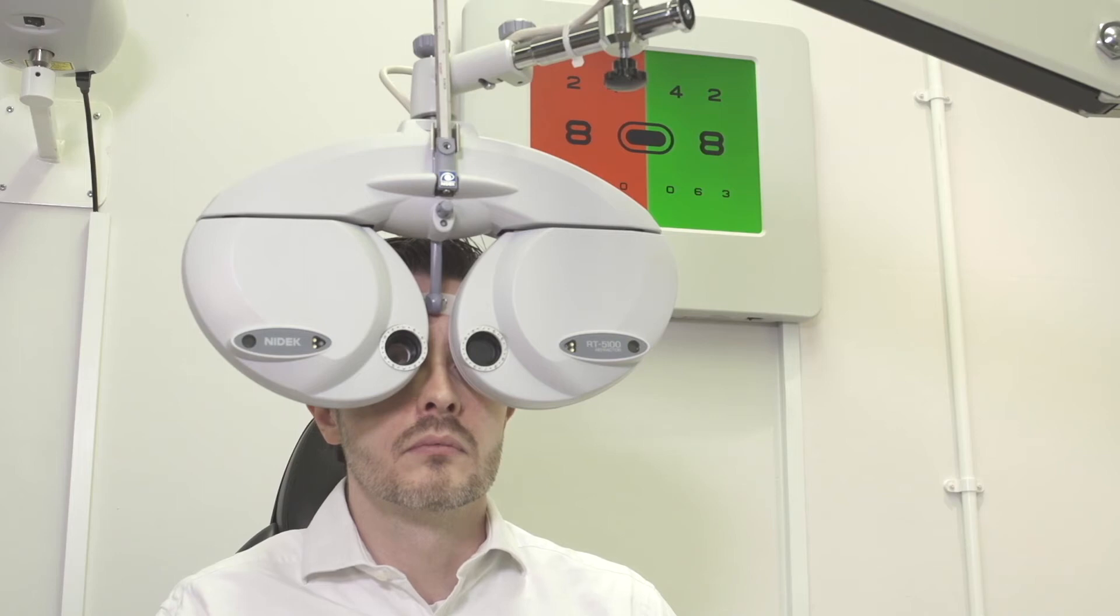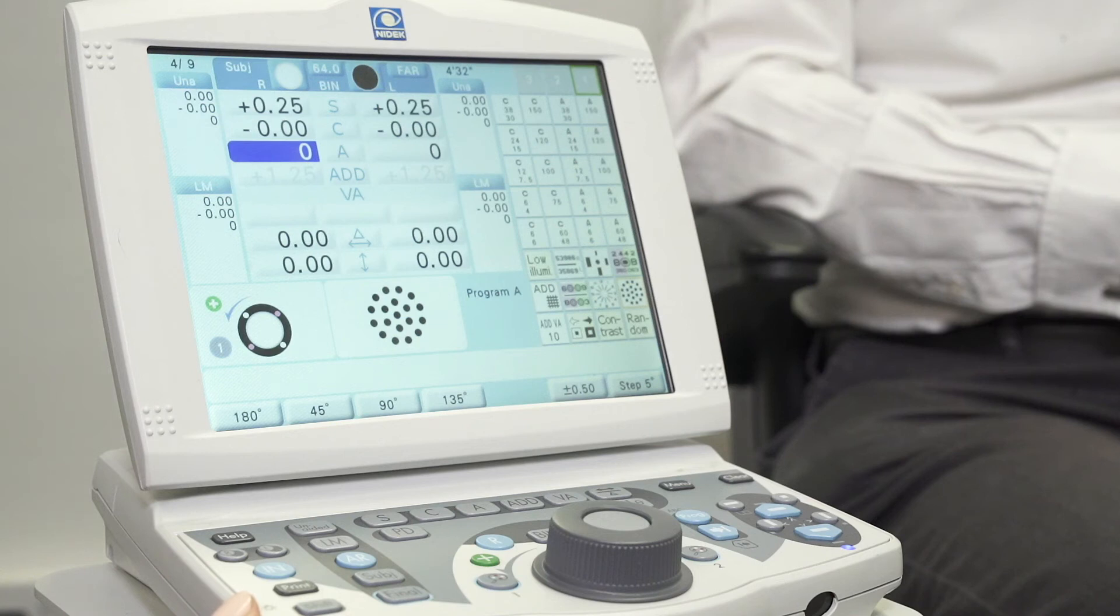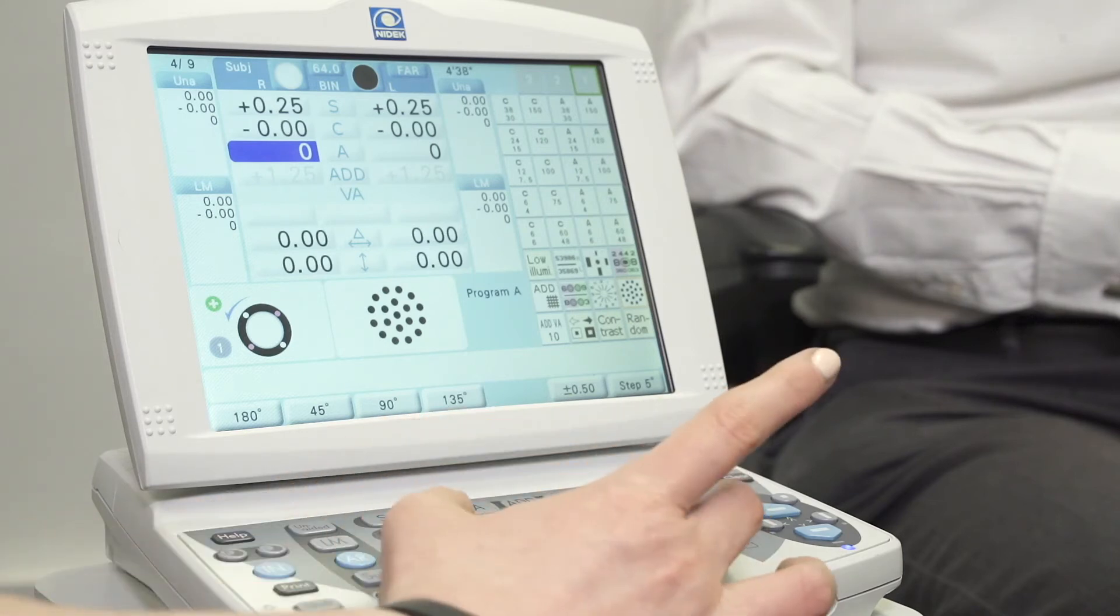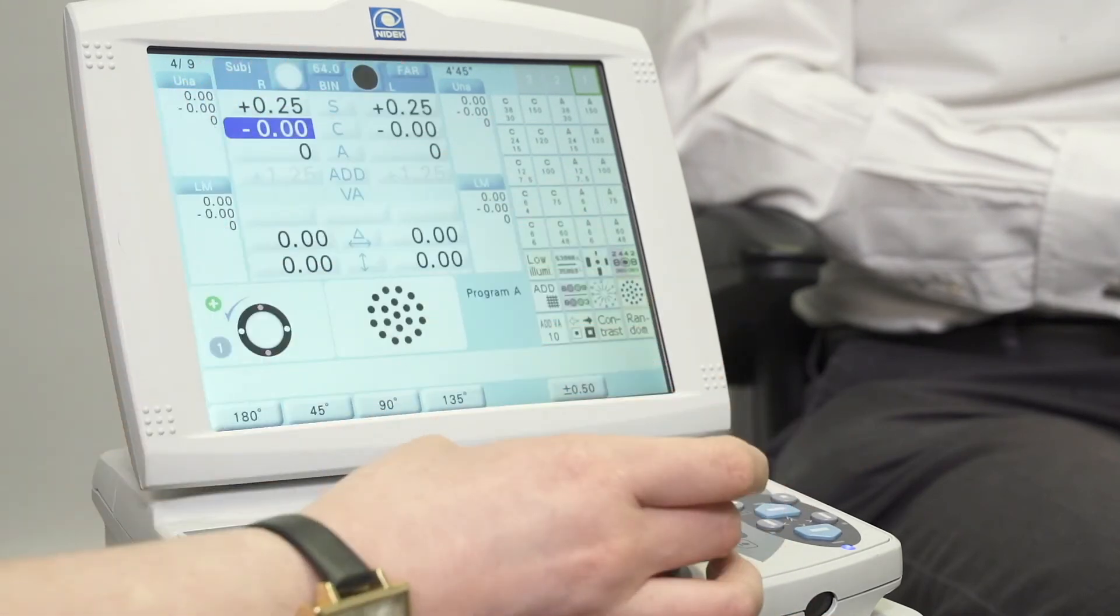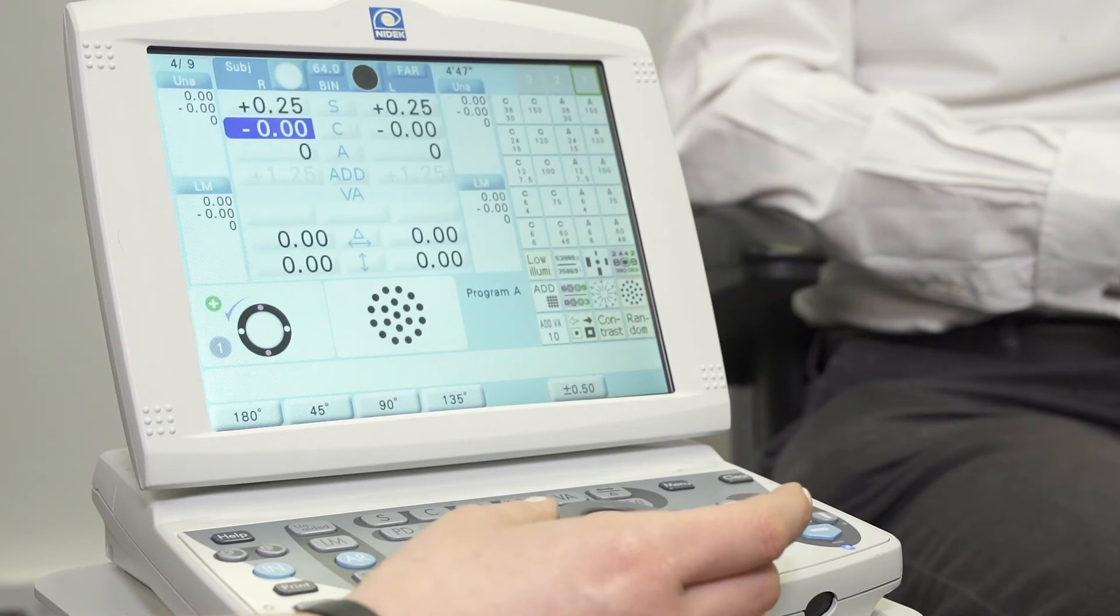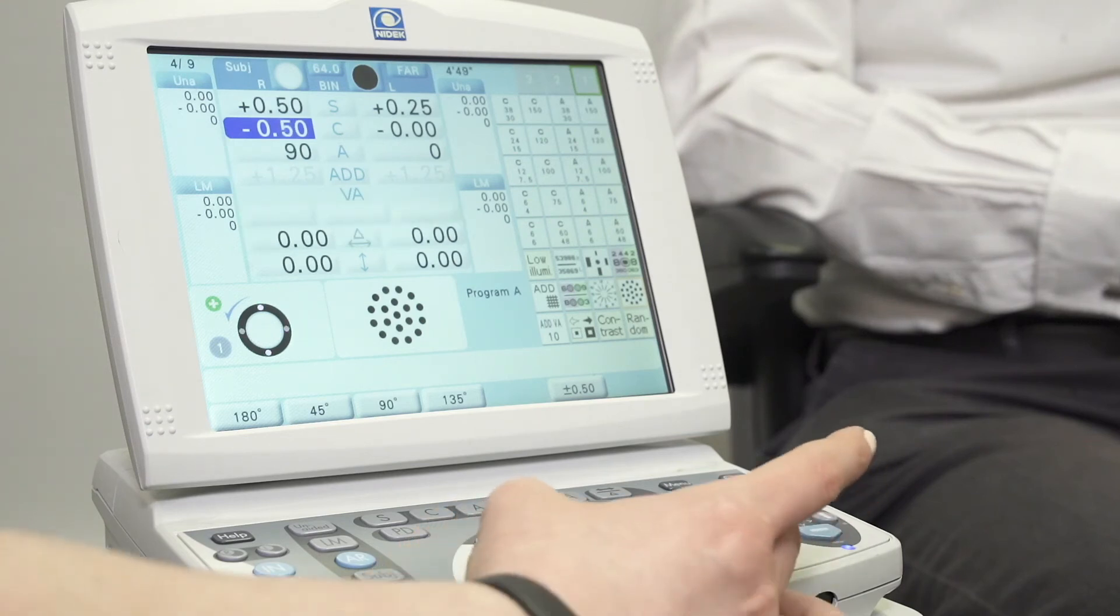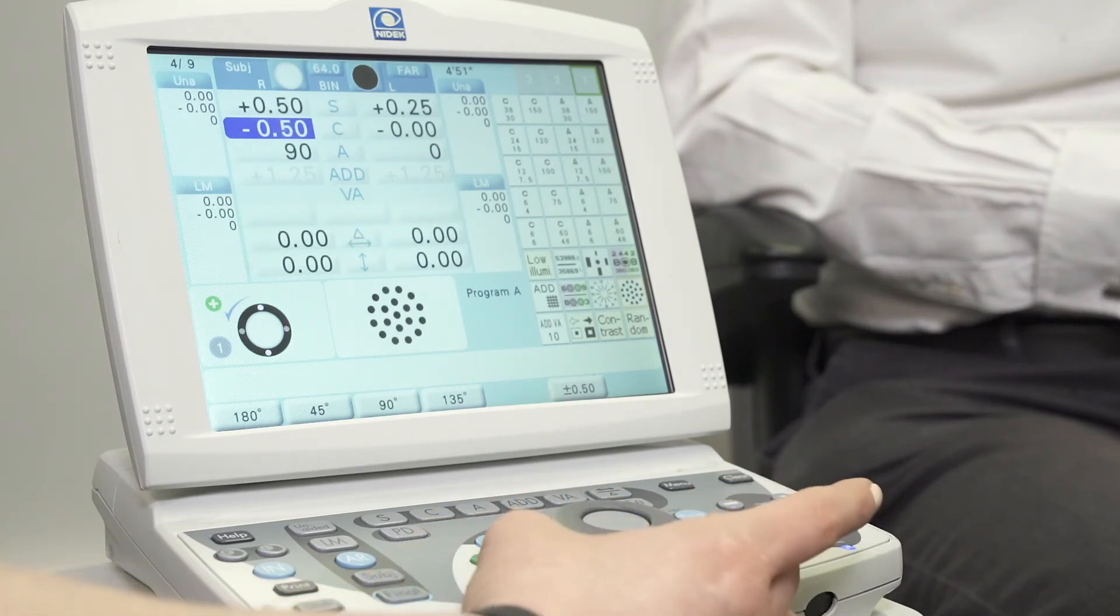Once we're happy, we'll move on to the cross cylinder technique. Starting off by trying to refine the axis, we're asking the patient whether the dots appear rounder and darker or clearer with option number one or option number two. Once we're happy, we can move on to refine the power in the same way, either by using the dial or by using the two options just here.